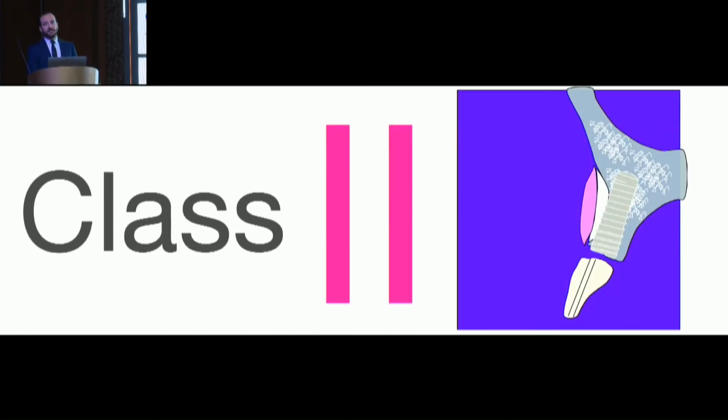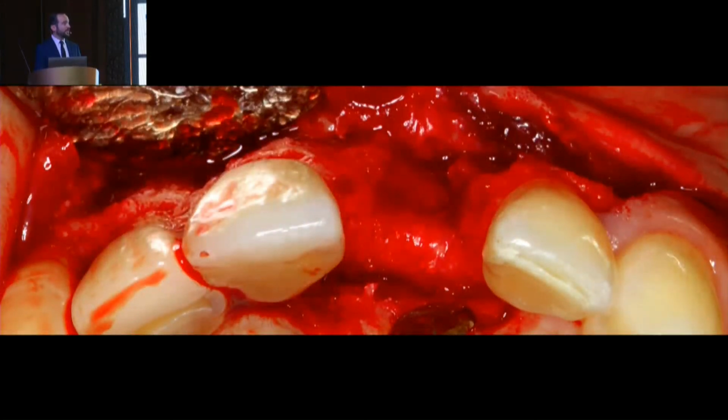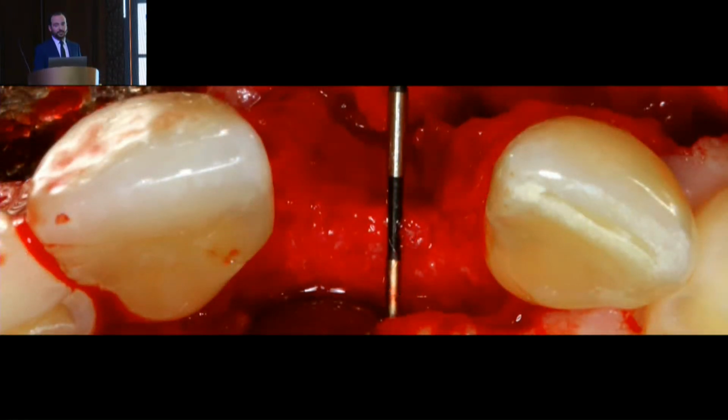As a quick reminder, these are implants that can be installed. We have sufficient bone. We can place the implant in the ideal position, but we have either a small fenestration, deficiency, or a combination of both. Patient with a missing central incisor. We take a look and we realize that yes, we have bone mostly on the palatal side, but we have a deficiency. I mark here the deficiency, more or less like a cone shape, and this is sufficient in order to achieve primary stability of our dental implant in the ideal position.